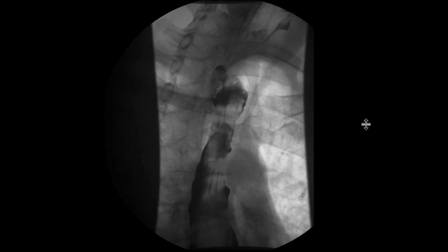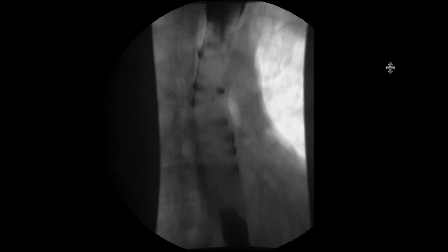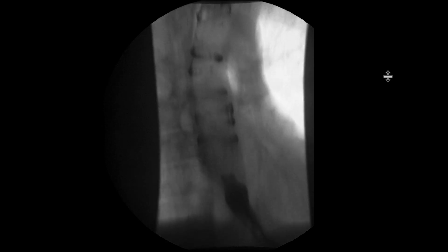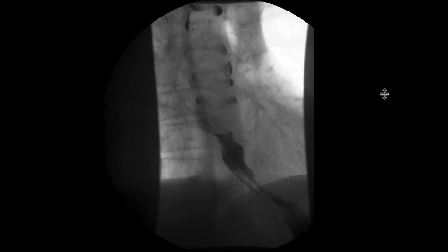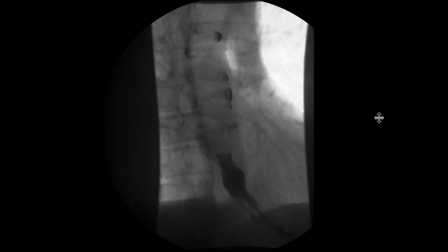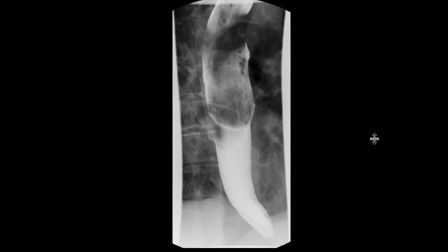You may start to appreciate that there's a bit of a filling defect in the esophagus. It's rather large — you can see quite a large filling defect spanning really the upper to at least the middle aspect of the esophagus, and even the distal aspect as well. After a few subsequent swallows to delineate this, you can see beautifully this large filling defect in the esophagus.